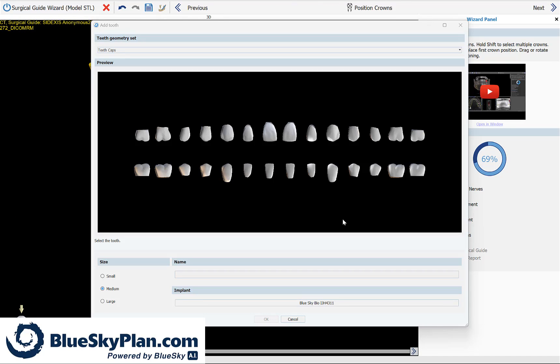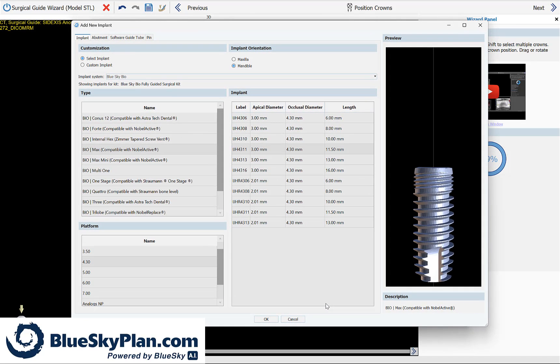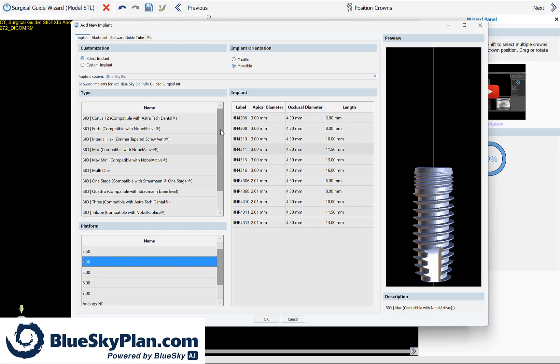Select the relevant tooth to be added to the treatment plan by left-clicking on the tooth. You have the general overall size of the tooth in the bottom left that you could select. Click the implant button to select the implant system width and length of the implant that you want to place.